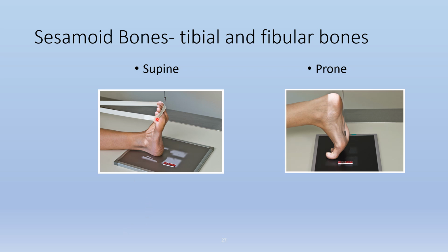If they're not able to achieve this, because ideally you would want the plantar surface at a 15 to 20 degree angle from vertical. So this surface should be between 15 to 20 degrees from straight up and down, just like in here. If they're not able to do that, it is possible that you would have to angle more than that in order to achieve that 15 to 20 degree angle from vertical.